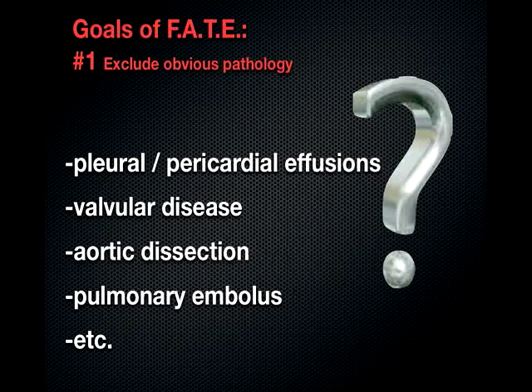So back to the goals of FATE. Number one goal was to exclude obvious pathology. These are things such as effusions, obvious gross valvular disease, dissections, which are rare to find on point-of-care ultrasound, but we should look for them anyway. Pulmonary embolus.